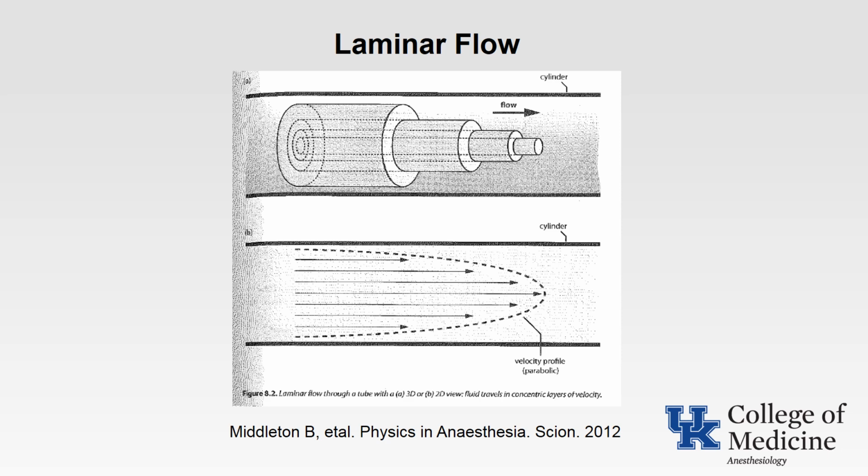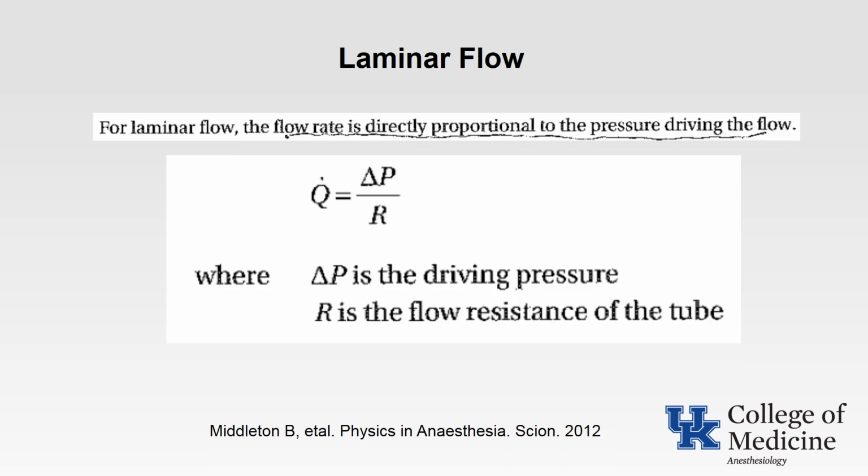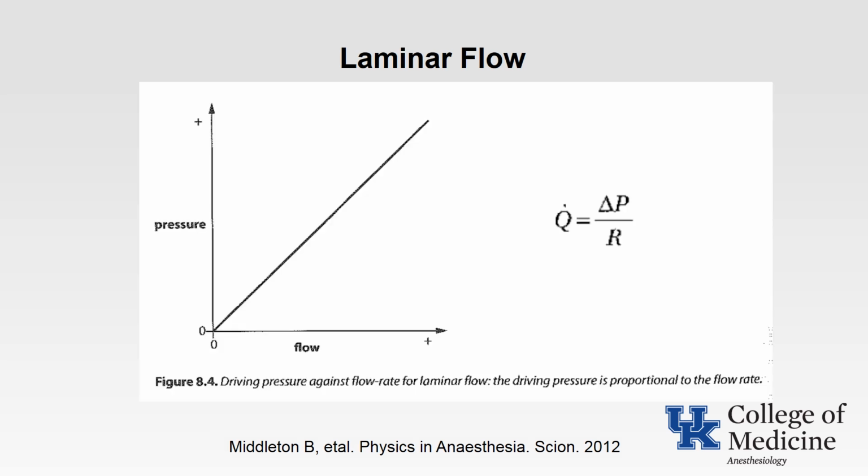This diagram's laminar flow and the fact that pressure is related to flow and resistance. Notably, the pressure drop is directly proportional to flow.